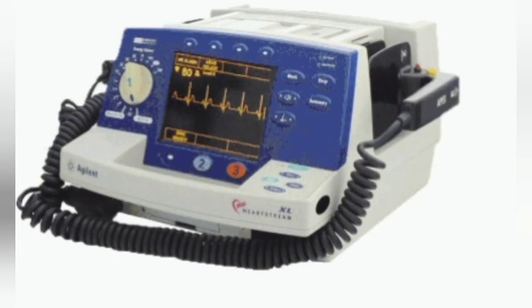Hi all. Now I think you might have seen a student activity video about defibrillator, where the students had a small discussion about the definition of a defibrillator and the basic types: internal defibrillator and external defibrillator. You may also have different types based on the current used, that is AC and DC.